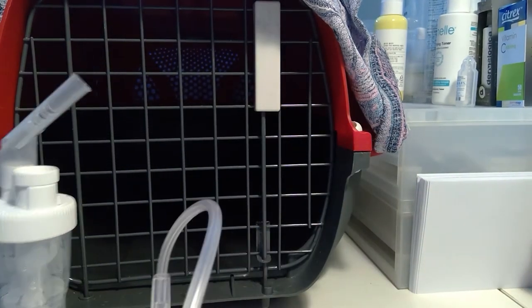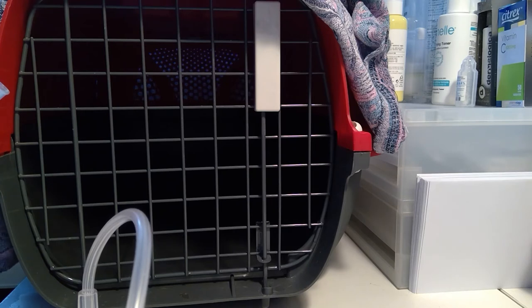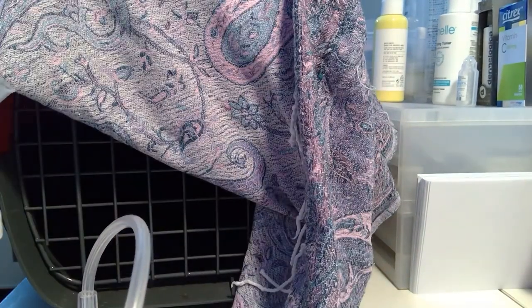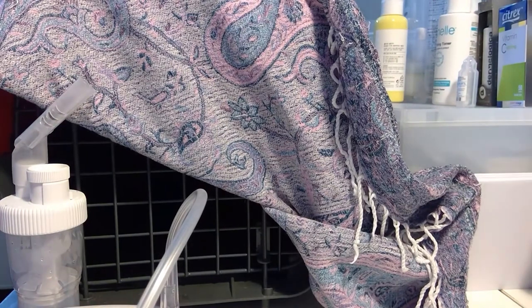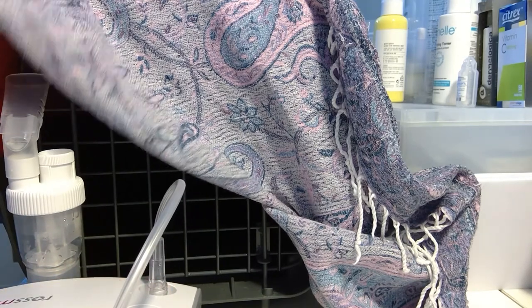Not all cats are okay with it immediately — it takes some time. It's always best to try and see, give the cat a few seconds, observe how it reacts, then increase minute by minute. I'll put the nebulizer in and make sure it's on a flat surface, because if not it will make a very weird sound. The kit itself — I'll make the mouthpiece rest on the side of the carrier, close everything up, make sure it's snug.